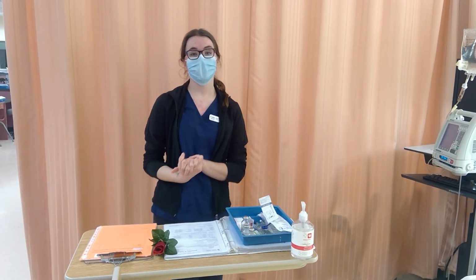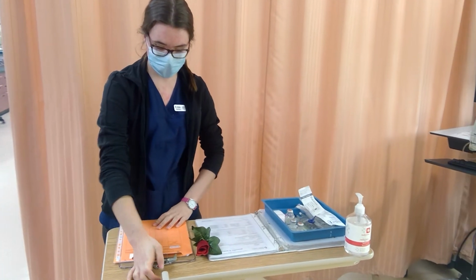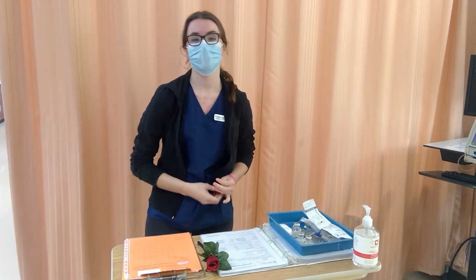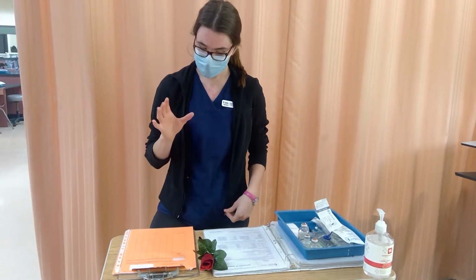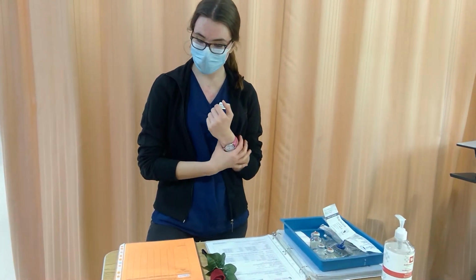Hi, my name is Melannie, and I am a student nurse here to give an IV medication to this patient. First thing I'm going to do is check my doctor's order. I see that he is ordered penicillin 2.5 million units because he has cellulitis in his arm after having a bee sting and then scratching it. So we know the purpose, and we know that he's allergic to walnuts.